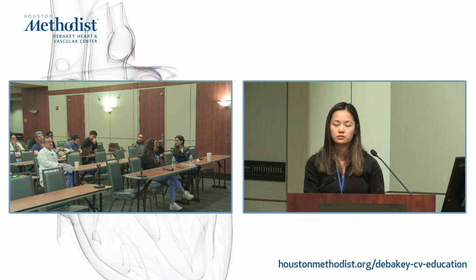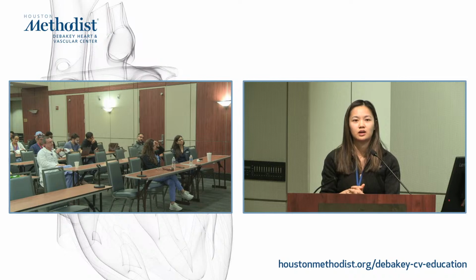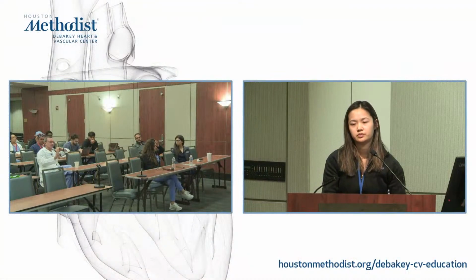And so, how do you fix it? How do you get a horizontal annulus? What are the tips? Because that's what is really the workhorse image for all these cases. I'd say from my personal experience, the clock, the probe itself, can sometimes help orient your heart, making sure the heart is more horizontal. Not sure if retroflex sometimes helps as well. Yeah, it often can, and often you're too deep, so sometimes pulling the probe back, playing with the wheel.